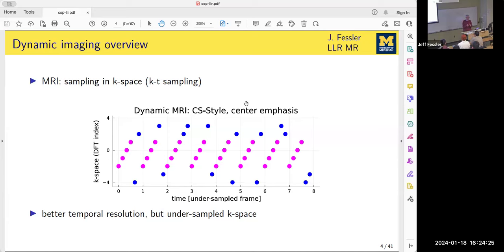And if that's happening, then that means you need to back off on how aggressively you're undersampling here, right? How aggressively we undersample involves this trade-off between spatial resolution and temporal resolution. And I think the field is still figuring that out. But I can guarantee you, if we undersample too aggressively, at some point we will lose the distinction between abnormal and normal tissue, and then we need to back off from that. And I feel like we'll have a better chance of figuring that out in this convex setting than we ever will with black box deep networks. But that's a whole other discussion, right? We need to figure out those limits for those kinds of methods as well. It's a great question.